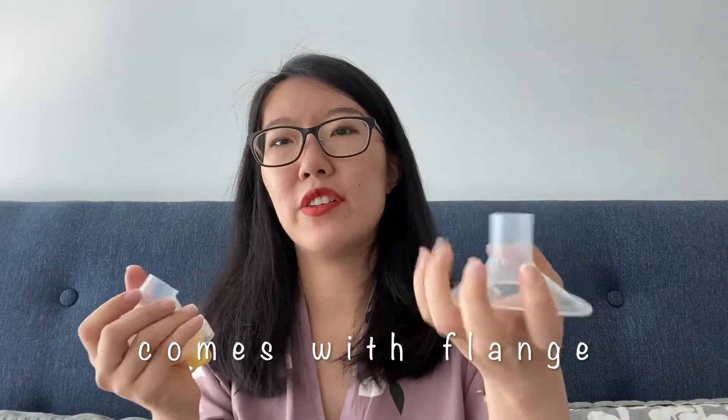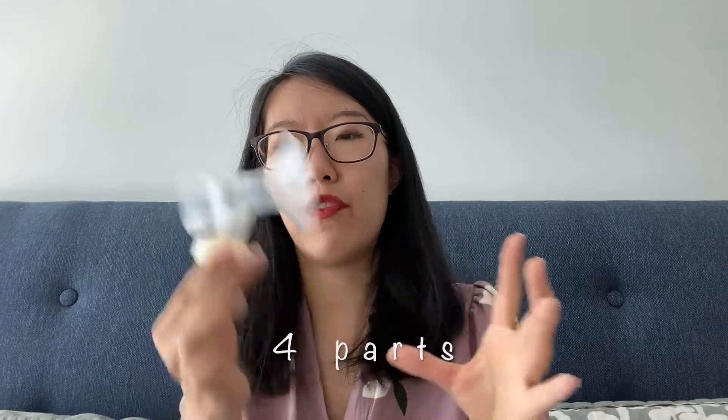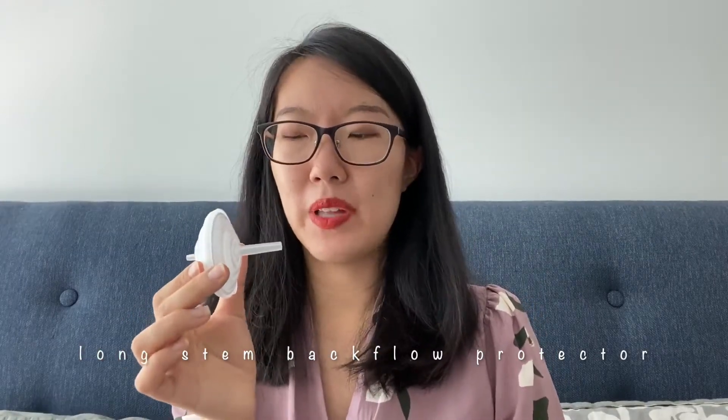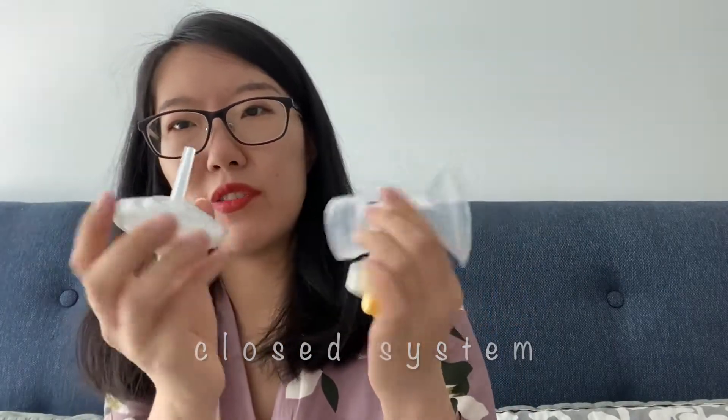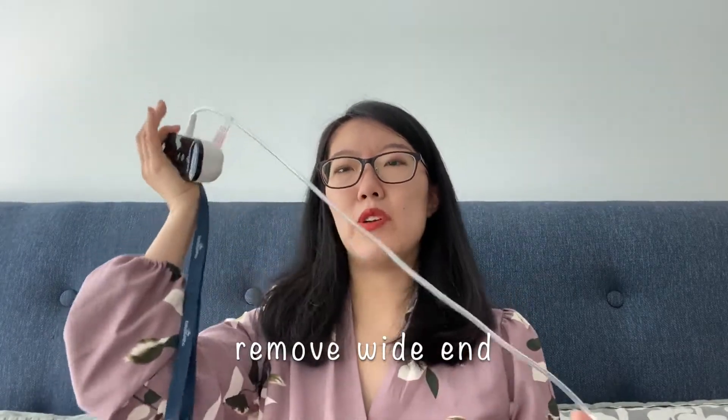Another hack is to use this pump with Medela. I got this Medela from the hospital. It comes with the flange — the flange actually comes apart. I'm using a 24 millimeter flange, this membrane, and also this duckbill — so four parts total. In order to make Medela compatible with Baby Buddha, you have to get a long-stem backflow protector, because Medela is an open system. With this protector it will change it to a closed system. You insert this long part into the hole, and then remove the white end and connect it with the shorter end.